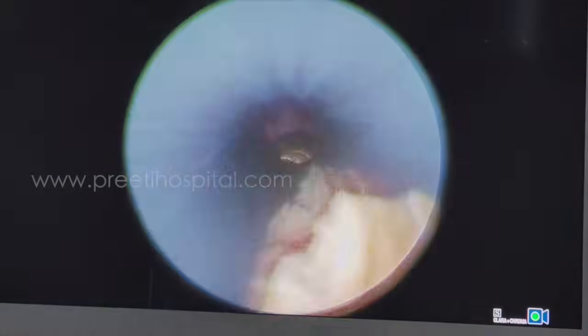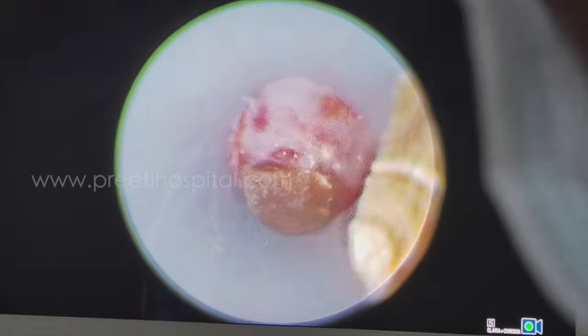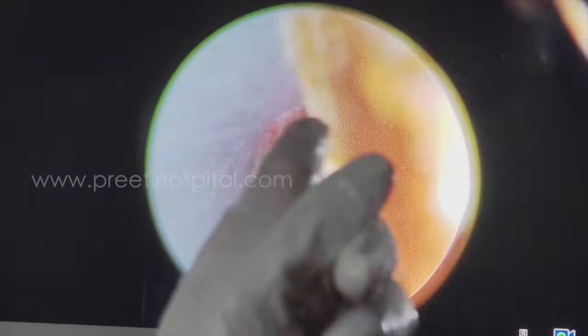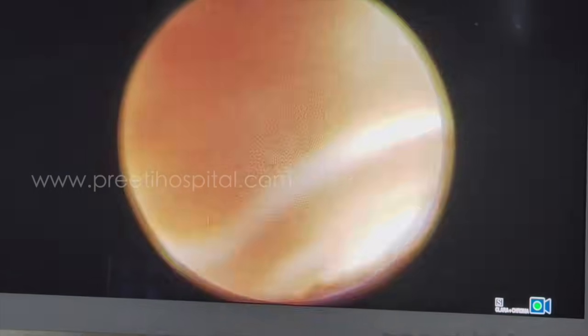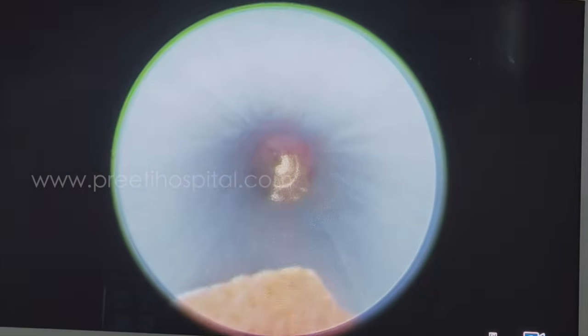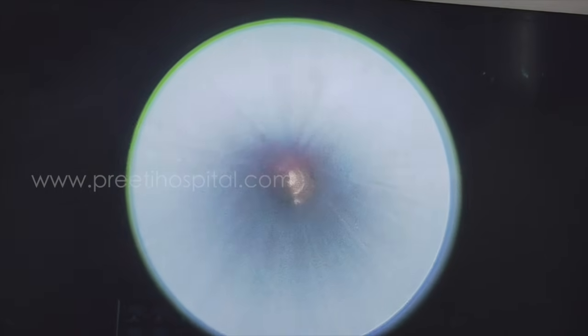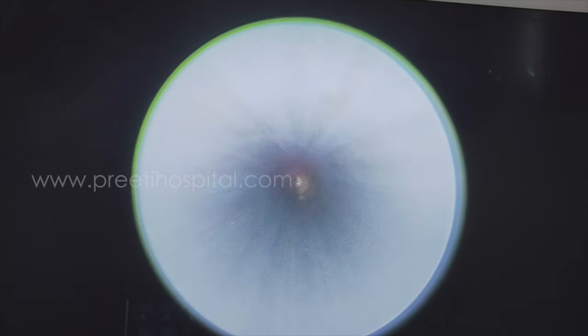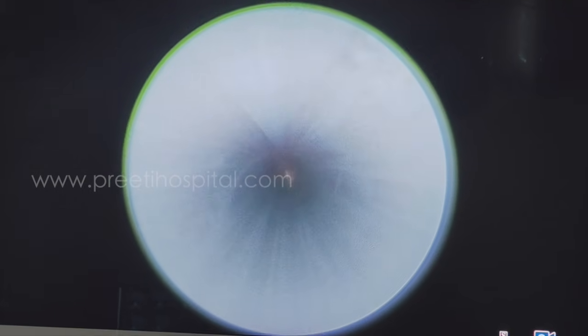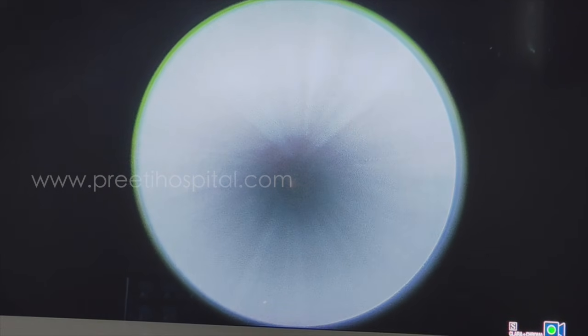This amplatz sheath — it is hitting the wall there and slowly I have to come. More easily it will come in supine because of gravity.